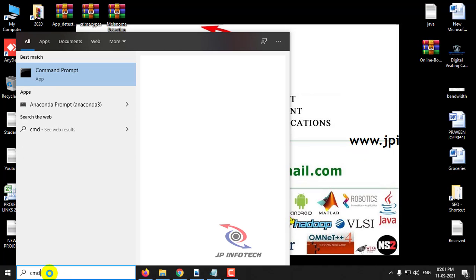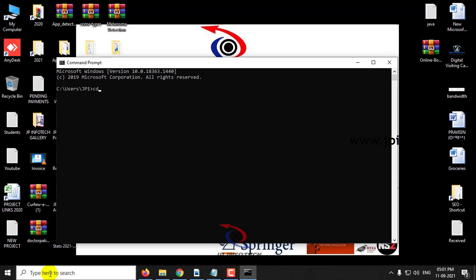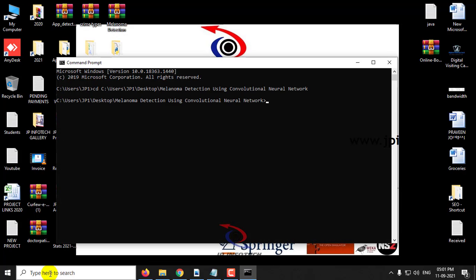Just copy the source code location, go to your command prompt, type cd and the location. Now type python app.py.